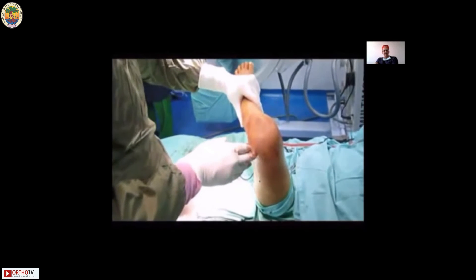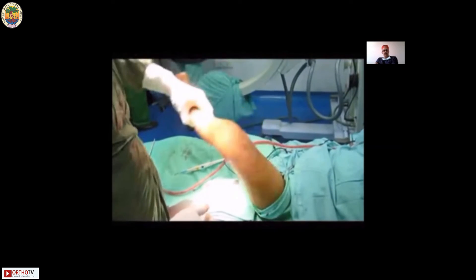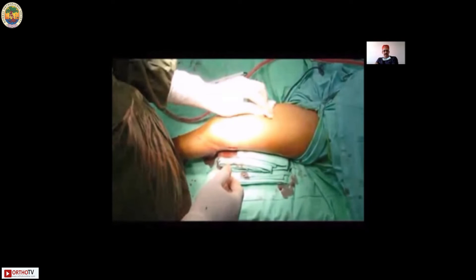Always check rotations — they must be equal, as a mal-rotational reduction may cause an abnormal gait pattern in a child. Check version correctly. Once done, take subcuticular sutures and apply a gamgee dressing with a crepe bandage. The ideal indication for titanium nailing is transverse or short oblique fractures with minimal comminution, in children aged 5 to 12 years and less than 49 kilograms — heavier children are not recommended as the construct may be unstable. After 48 hours, when pain is less, start bedside knee bending exercises, and the child starts walking on a walker on the third to fourth day. Toe-touch and partial weight bearing can commence at the end of the third to fourth week, and by six weeks you will see superb callus around the fracture site and the walker can be removed.